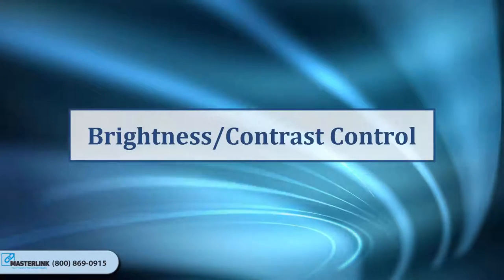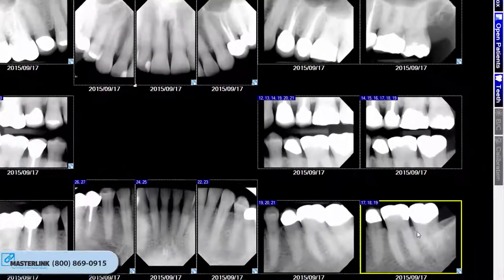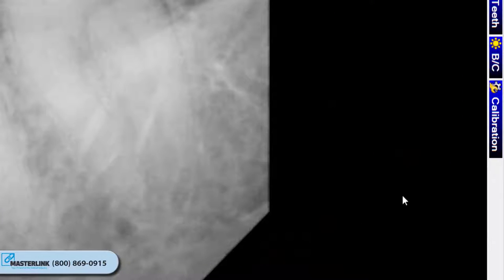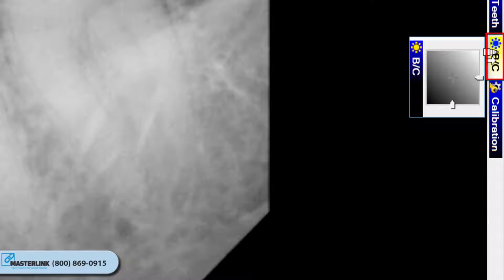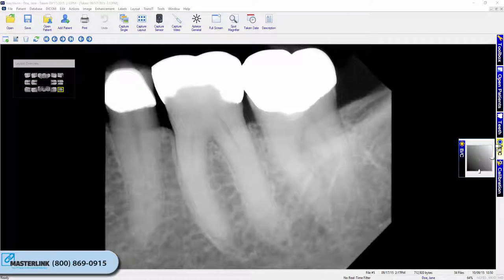Brightness Contrast Control. The imaging application offers an easy-access BC adjustment tool that can be used for diagnostics. To utilize the tool, open a patient image for viewing. Select the BC icon on the vertical toolbar to the right of the user interface. The Brightness Contrast Control is only available for grayscale images.